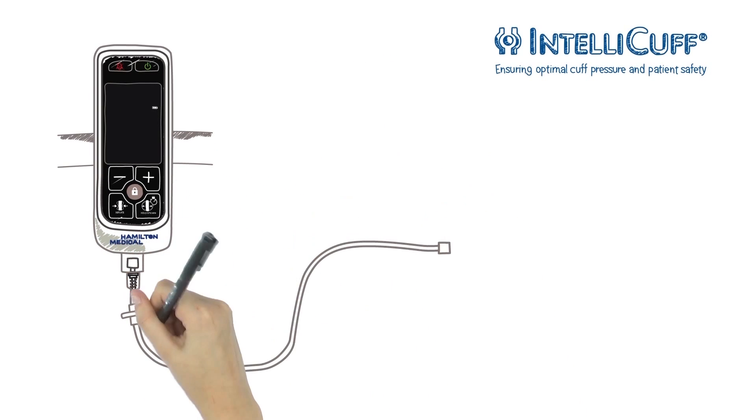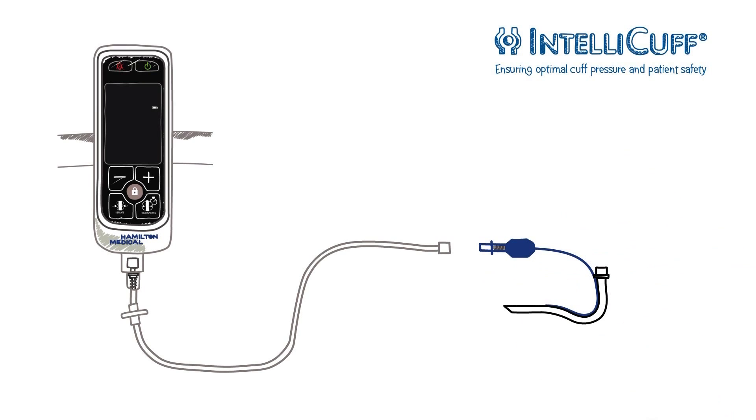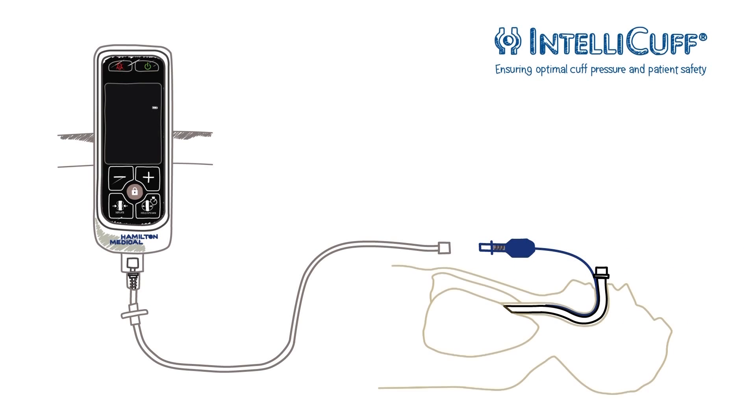The disposable tubing developed by Hamilton Medical is designed to fit the luer connector on a variety of cuff tubes. It includes a bacterial filter and a shut-off valve.